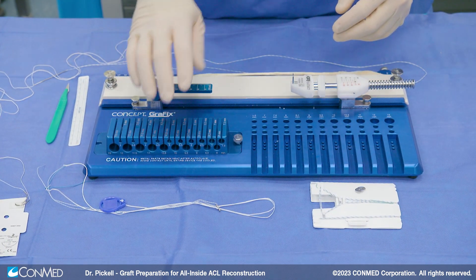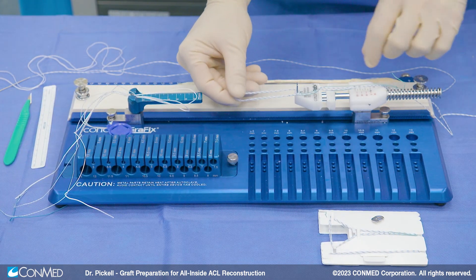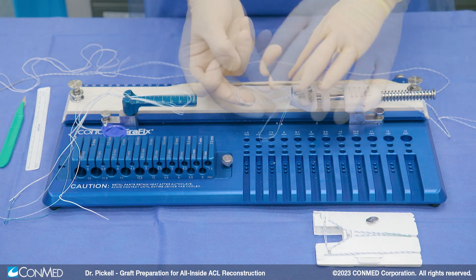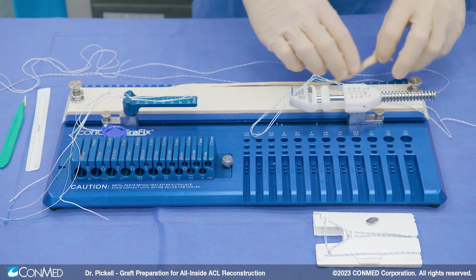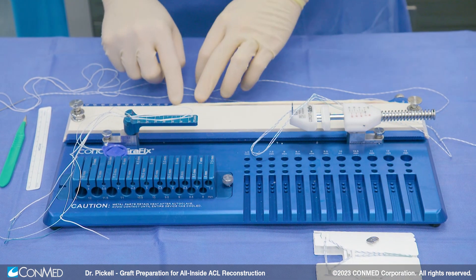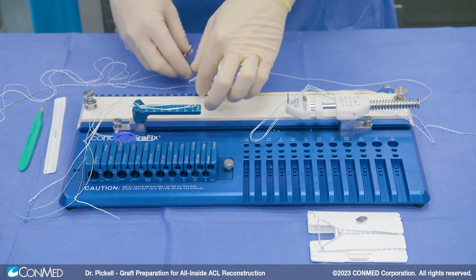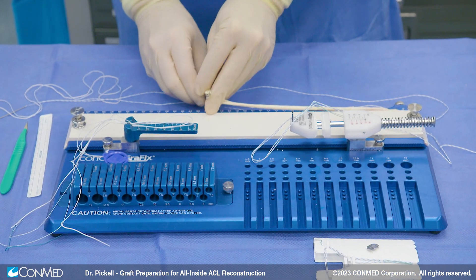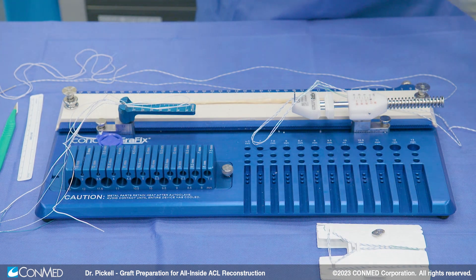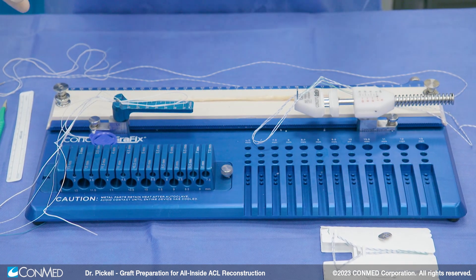The first thing we do is attach our buttons to our system. We're going to attach our femoral button here, ready to go. Our tibial button we're going to attach to the tensioning device. I like to use one that has a spring-loaded tensioning device so we can put our graft under tension at the end. Here we have our two buttons ready to go. Next thing we're going to do is trim down our tendon. The ideal length is around 270 millimeters — this graft right now is about 290 — so we're going to trim that down to somewhere around the 27 mark. It doesn't have to be exact, but it's going to help with our final graft length. One of the things we want is to be sure that our graft length is around 65 millimeters in total length, and that's going to help ensure that we don't have any graft issues when we're putting our tendon into our ACL sockets.